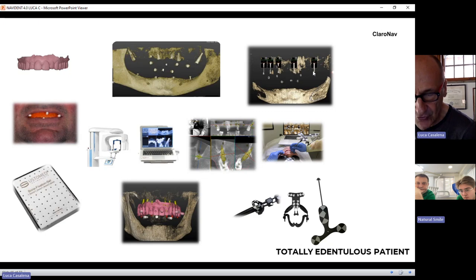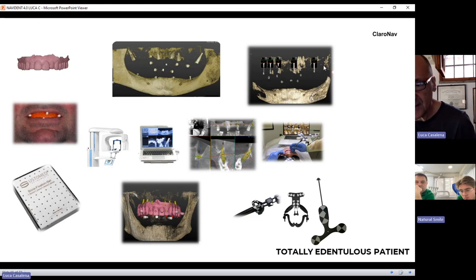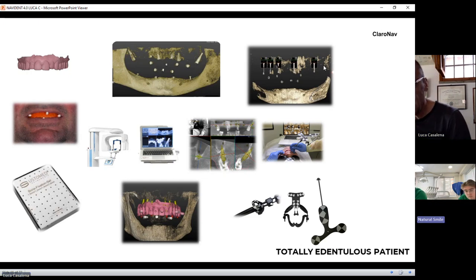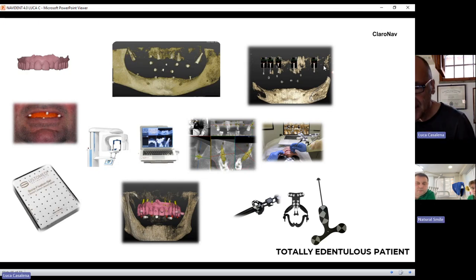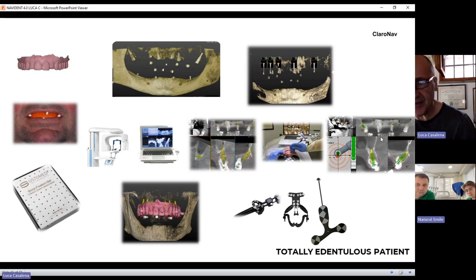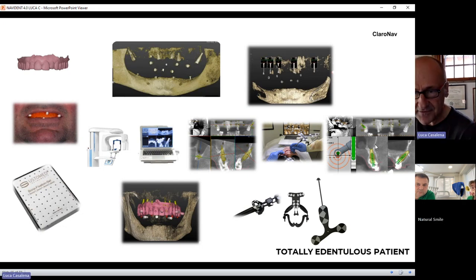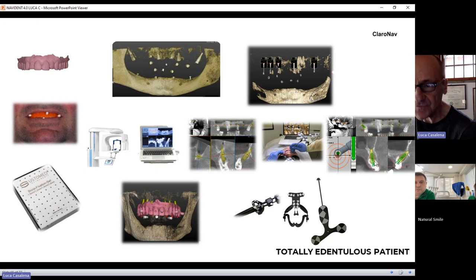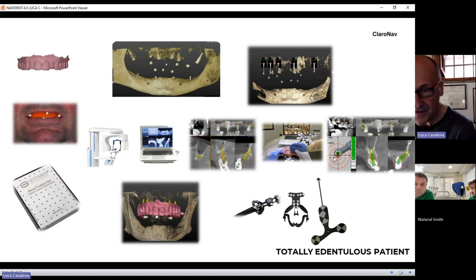Then you do the accuracy check: touch with your tracer any of these screw heads and you should see congruency — the same screw head touched by your tracer on screen. If there is congruency, you can move on. If there is a gap between the tracer and the screw head, something went wrong and the error must be fixed. If everything is positive, you start drilling. Drilling means you see a target — if you've planned implants, the center of the target is the axis of the planned implant. Stay in the center and keep drilling along it.